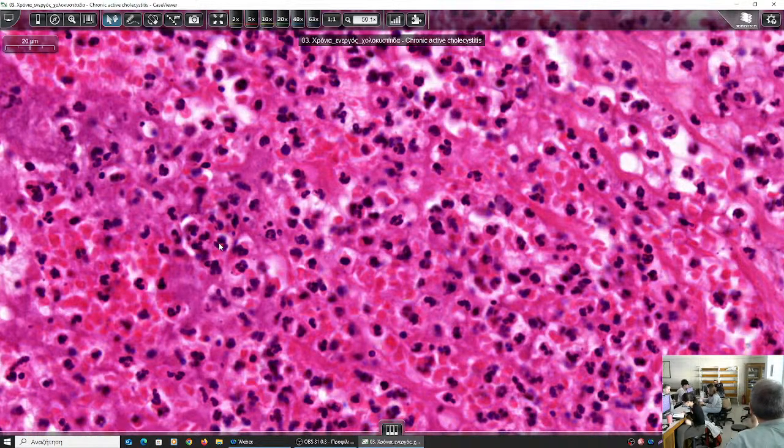If there is somebody who cannot identify these cells, now that we have shown them about 20 times, he'll call me and tell me where his home is, and I'll come during the weekend and have an extra lesson.